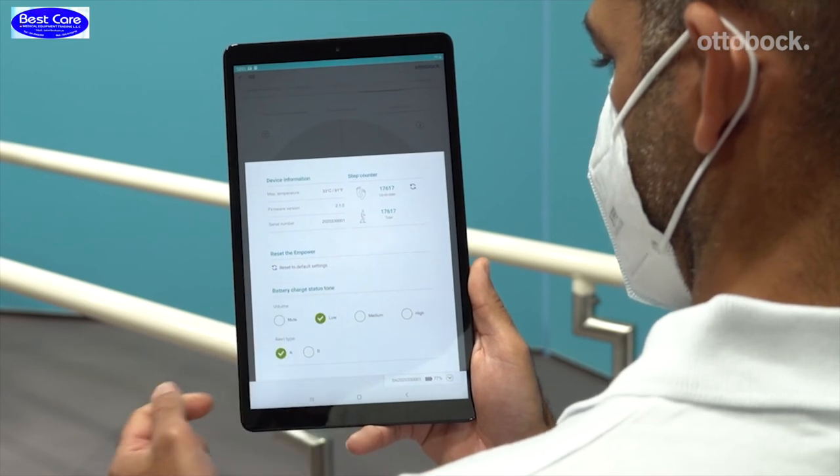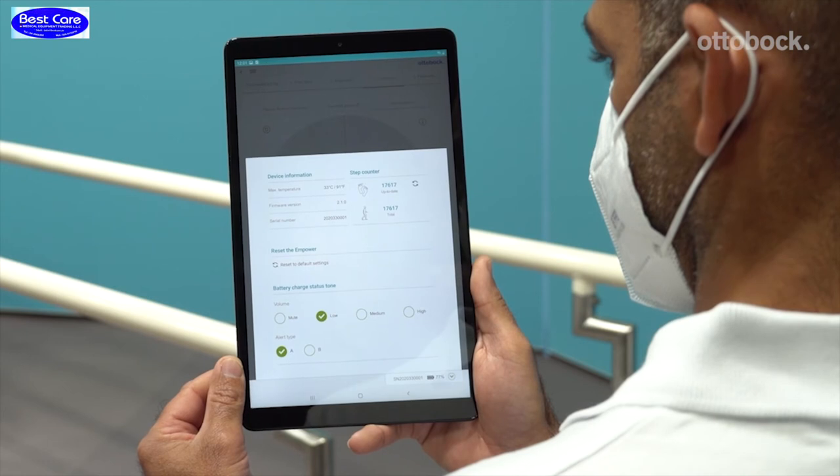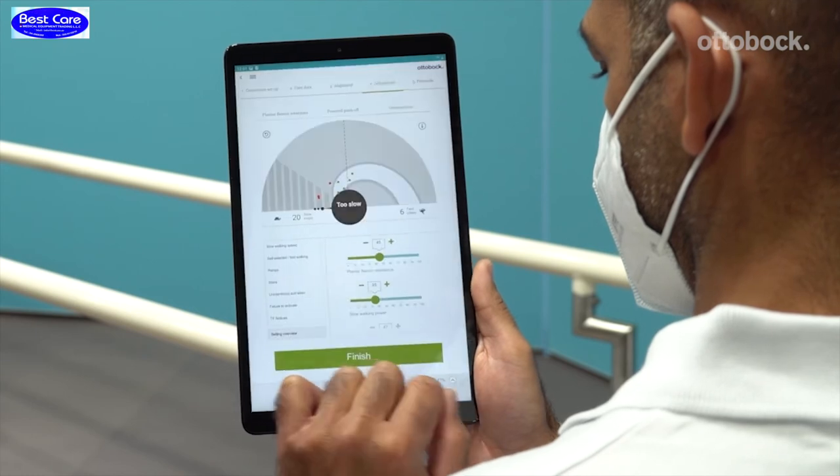In the middle, you can reset Empower to the default settings. Below, you can adjust the acoustic signal for the battery charging status. If problems occur during adjusting Empower, please view video 4 — it shows you how you can optimize settings.